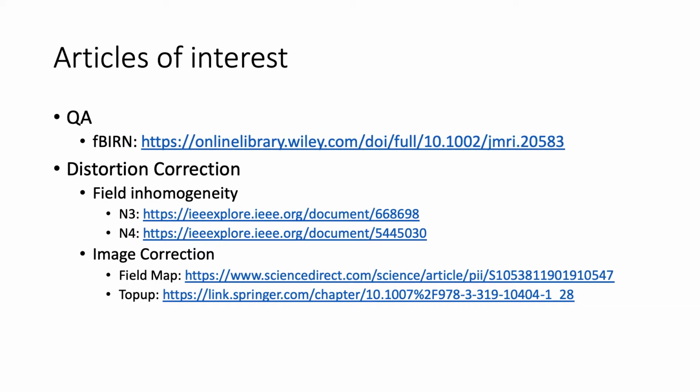Some conditions they don't get that, but you can imagine getting an air puff to the neck in the scanner, there's going to be some movement, right? So I might want to isolate that and see how much that specifically is influencing my signal and other quality metrics.